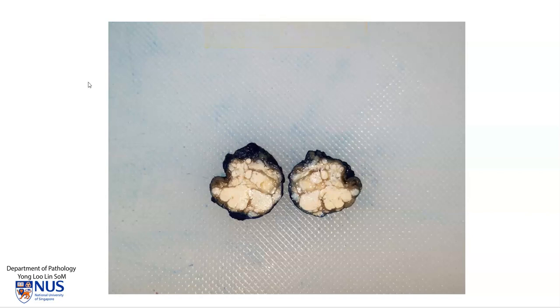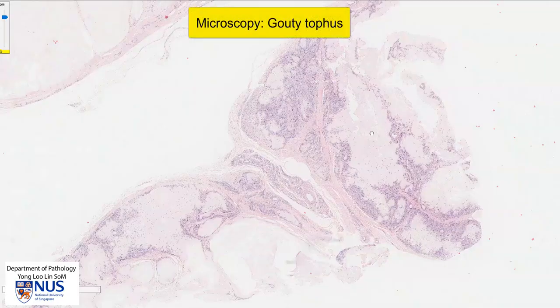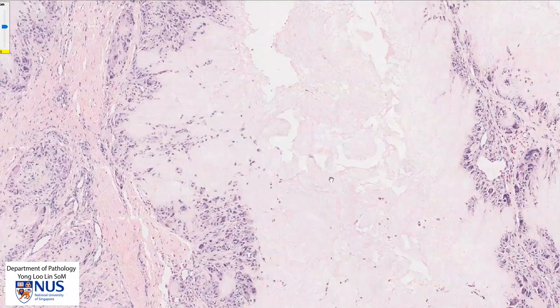Let's take a look at the microscopy. Here we see the histologic section, and we can see that there are some very amorphous, pale, pinkish deposits and they are surrounded by a cuff of cells. The deposits are actually composed of urate crystals or uric acid crystals.